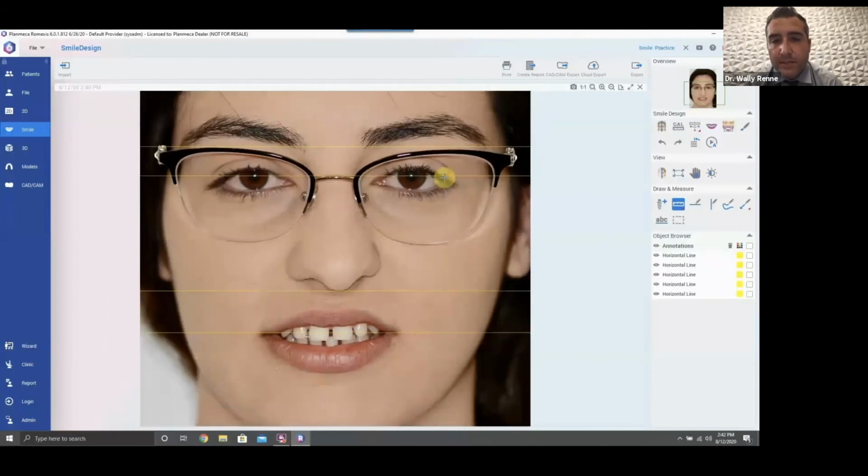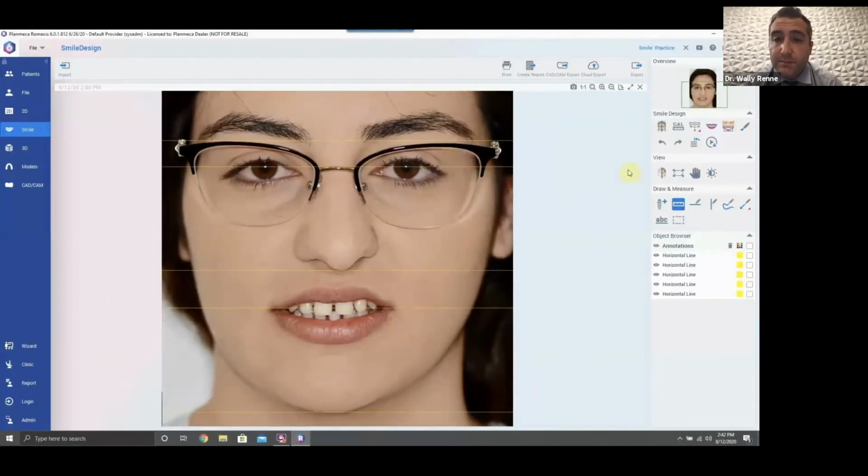And so I'm gonna go ahead and measure the facial thirds, and I'm gonna start with the midface. Now the midface is from soft tissue glabella to subnasale. Okay, and so here we're dropping a measurement of 61.7. The number's not important so much as the ratio. So now we're gonna measure the lower face. So it's subnasale to soft tissue menton, and we're at 66.